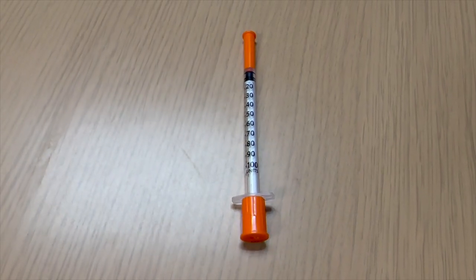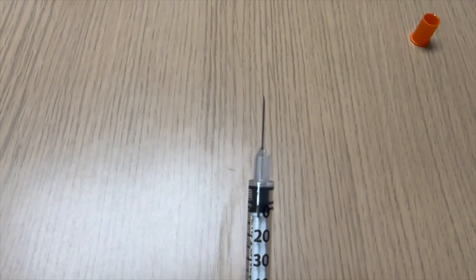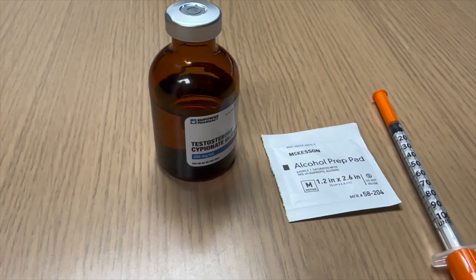First, you'll note that we like utilizing an insulin syringe, either a 27 or 29 gauge, one-half inch long. This makes injecting a breeze. Let's begin by preparing our supplies and drawing up the medication.